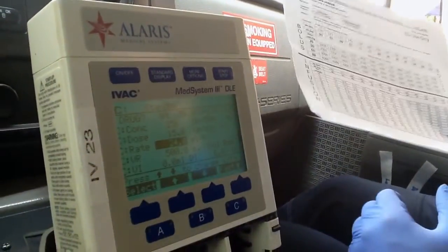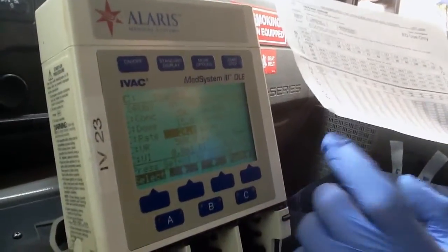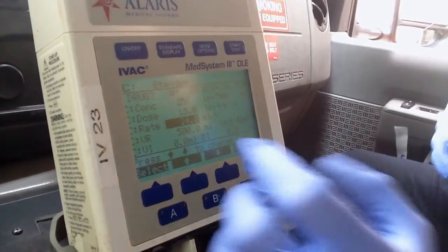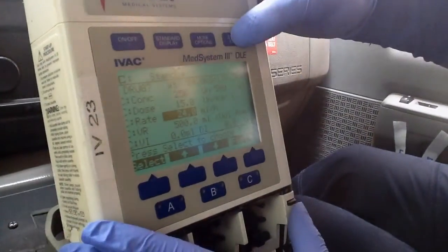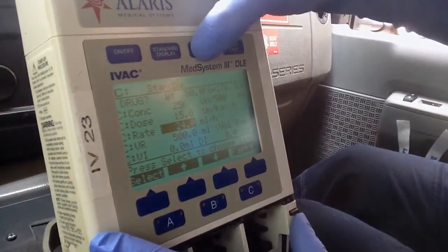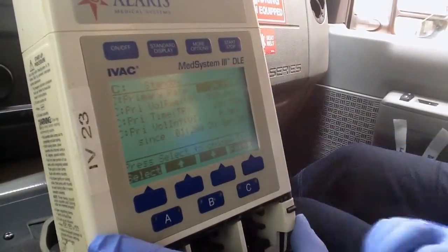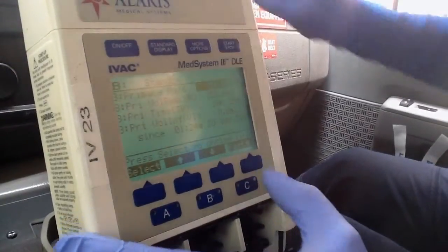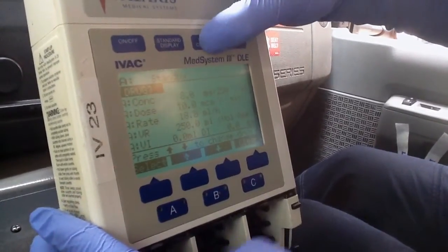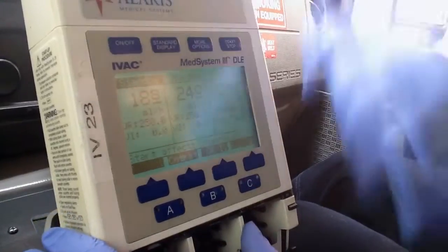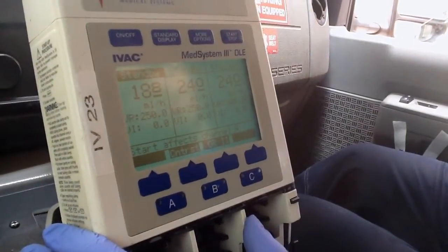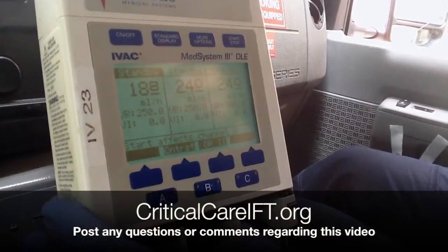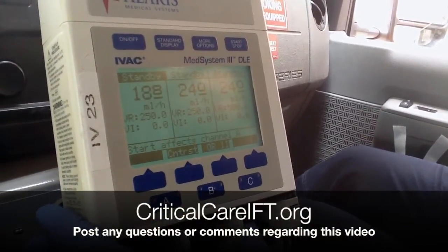After you've finished infusing, stop the medicine and exit the calculator. Go to More Options and select Calc Off for each channel — Channel B, More Options, Calc Off; Channel A, More Options, Calc Off — and you're back to the original pump mode. I'm going to post this on my website. If you have any questions, post them below.